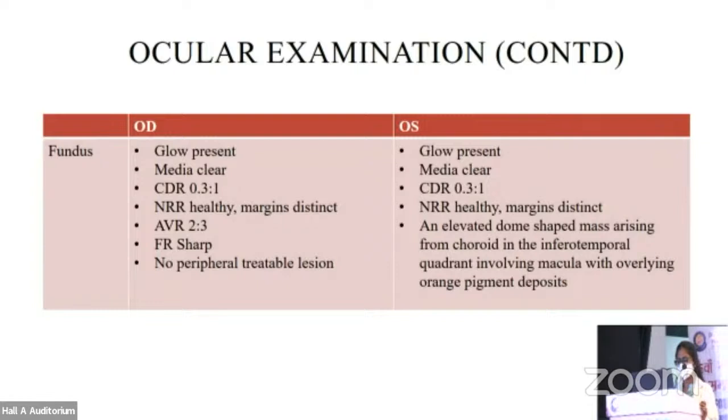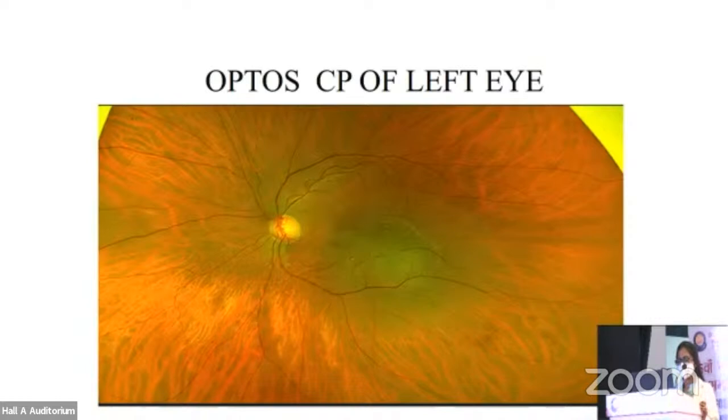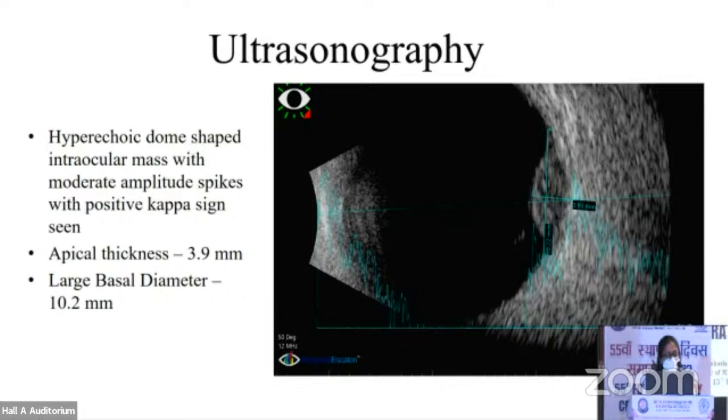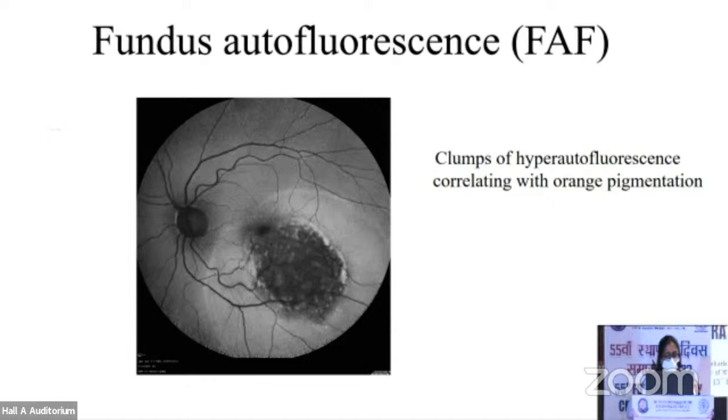This is an Optos picture of the left eye showing a dome-shaped elevated mass with orangish pigments, around 2 disc diameters away from the optic disc, just involving the macula. This is the Topcon image showing the same. Ultrasonography of the same mass lesion showed an apical thickness of 3.9 mm and a basal diameter of 10.2 mm. On fundus autofluorescence, clumps of hyperautofluorescence were noted, correlating well with the orange pigments.